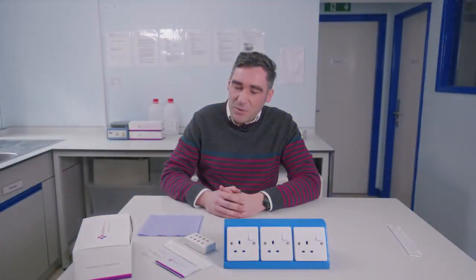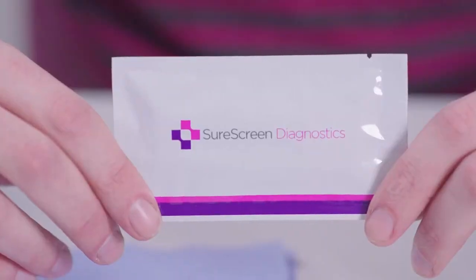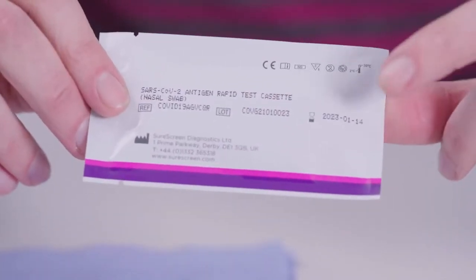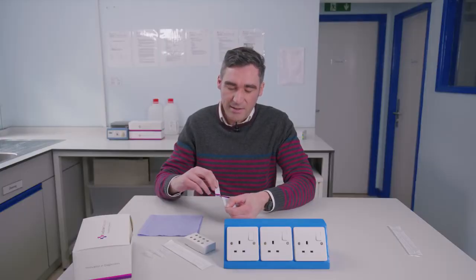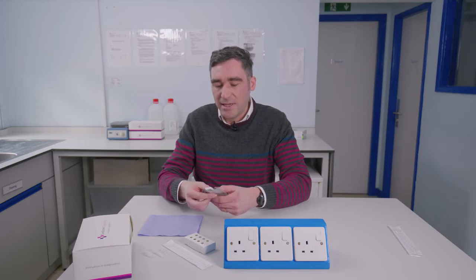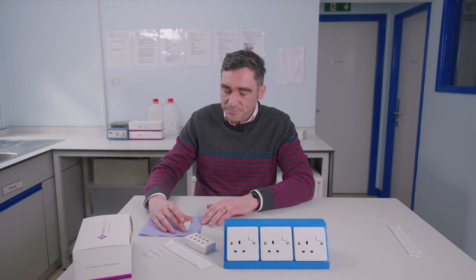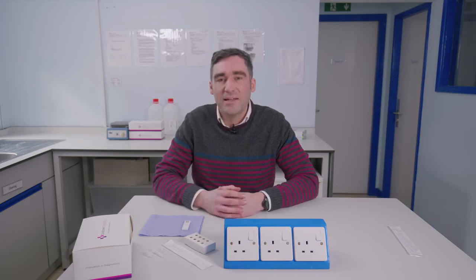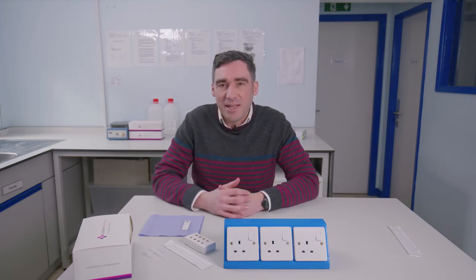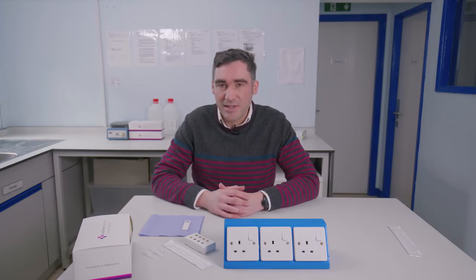The first thing to do when testing is to get the cassette and check on the back to make sure that the test is within its expiry date. Then it's a case of opening the pouch here and getting the test out ready to be used. Place that down and then we need to do the collection. We're going to use the swab and a sample is going to be taken from my nose, then we'll run the sample through the cassette.